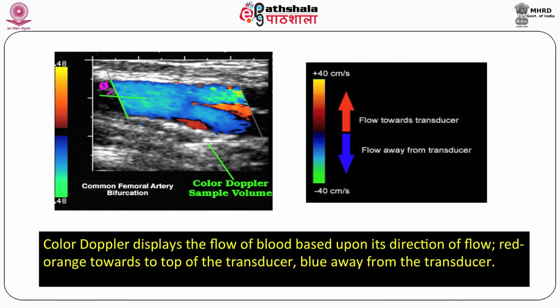The advantage of color flow Doppler is technical efficiency, global Doppler sampling, flow seen throughout the entire lumen, better localization of abnormalities, improved definition of the lumen, and rapid acquisition of data.